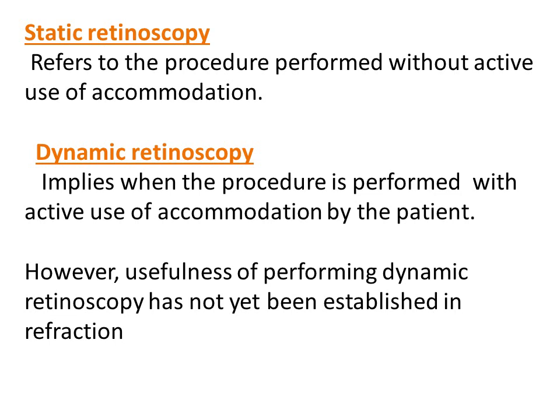Dynamic retinoscopy implies when the procedure is performed with active use of accommodation by the patient. However, in the textbook it is mentioned that usefulness of performing dynamic retinoscopy has not yet been established in refraction. So for remembering the terminologies, you have to just remember static retinoscopy and dynamic retinoscopy, even though there is not much of significance as far as dynamic retinoscopy is concerned.